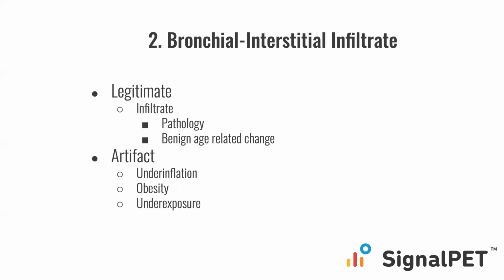If the lungs are underinflated, either it's a largish patient and they're recumbent, and you have underinflation, or simply, the world is real and it's not ideal, and it's hard to get a shot on peak inspiration in some patients, especially if they're panting. It may be an expiratory film. That can alter the appearance of the lungs. And of course, if there's underexposure, the film is too light, then that can change the appearance of the lungs.